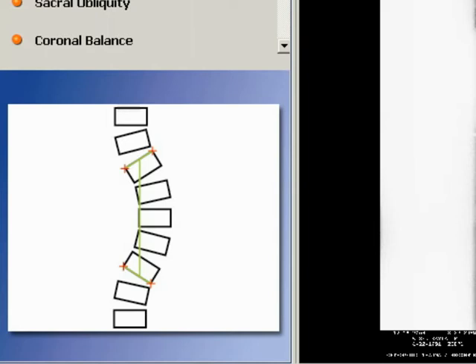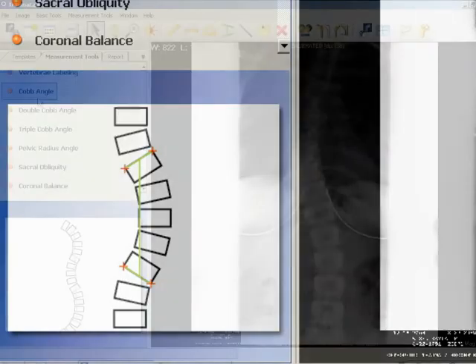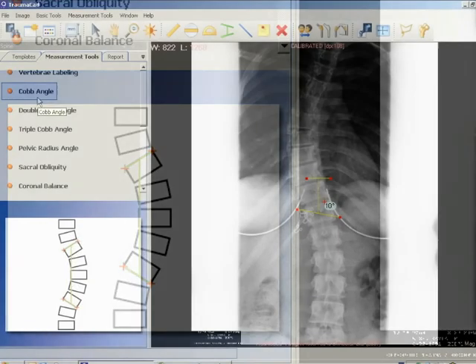The end or transitional vertebrae are then identified through the curve above and below. The end vertebrae are the most superior and inferior vertebrae that are least displaced and rotated and have the maximally tilted end plate.